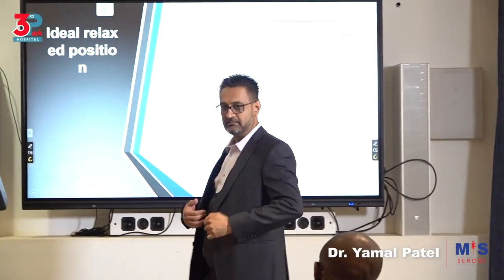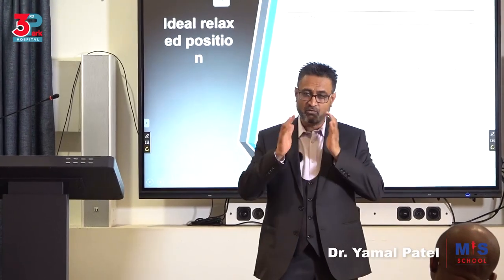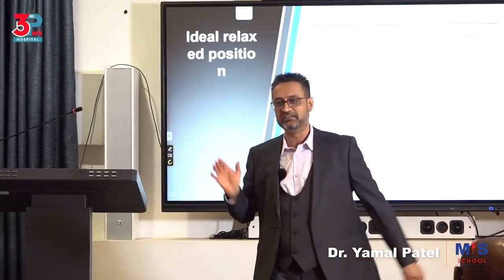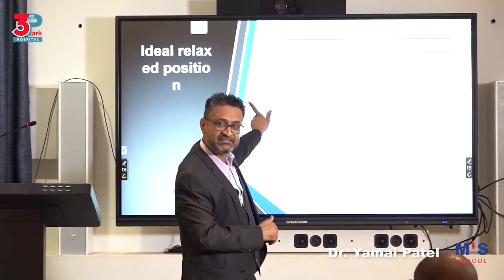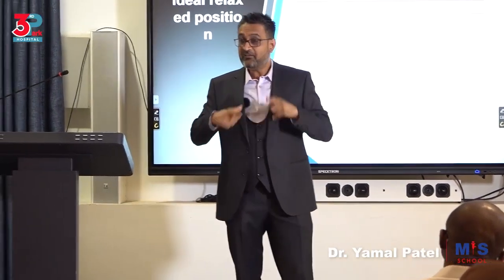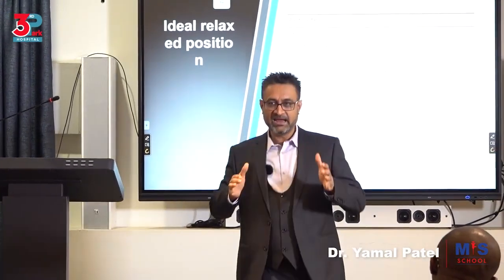When you go to a movie theater, those of us who may have noticed, what will you see? A certain level of theater movie ticket size seats disappear first. Not the balcony. The balcony is just expensive for people who want to spend money and sit behind there. That's fine. But the seats that will disappear first is FGH. FGH lines will disappear very fast. You know why? That's the line where the screen is fitting your angle of view and you're seeing everything so nicely. When you're here, you're seeing this big, so if you want to see something here, you'll have to do this and do this and do this. You've understood? So when you're close, it's a problem.